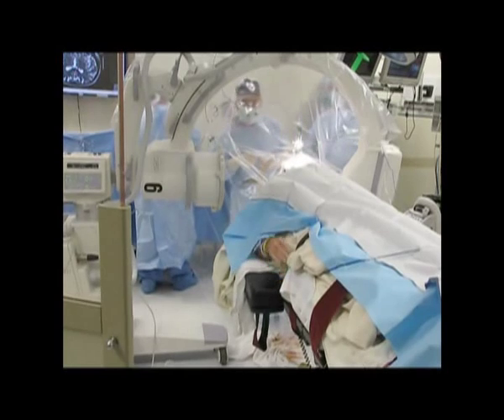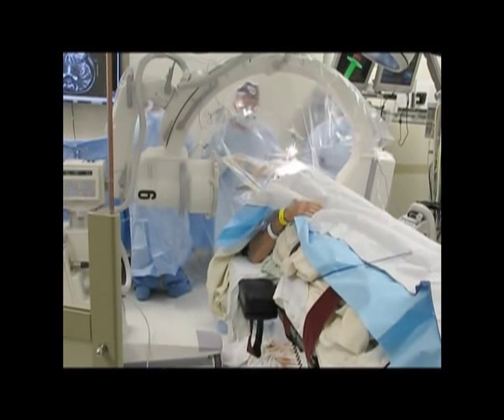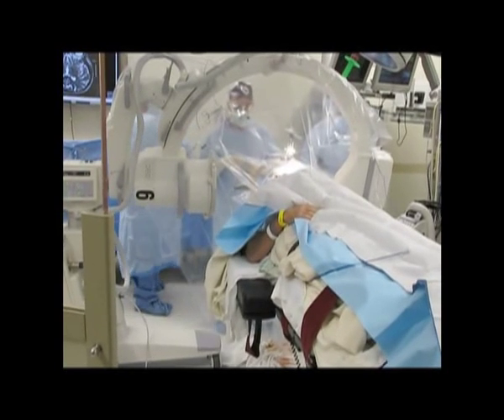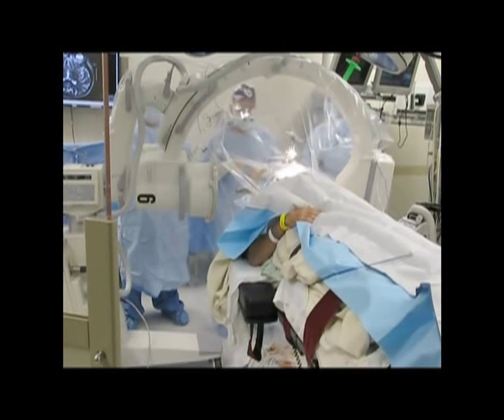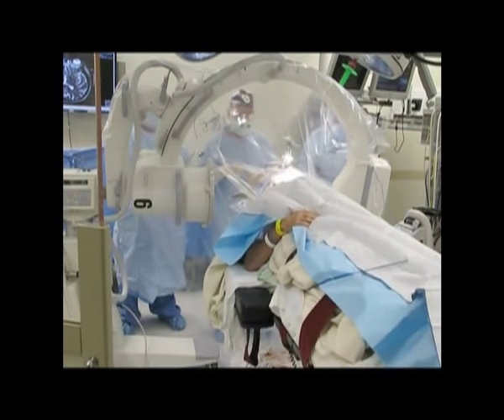So, Paul, can you hold out two fingers? Now put your arms on your belly for a second. There you go. Is it comfortable there? Now after one, your tremor is going to come back. Can you count to ten?